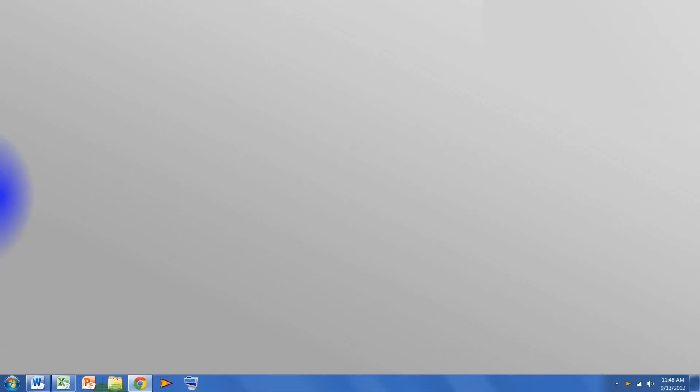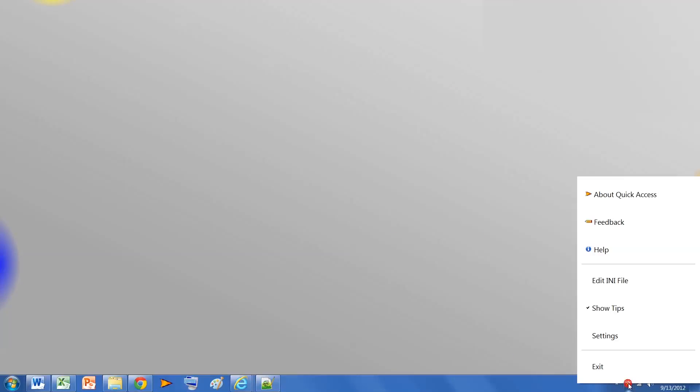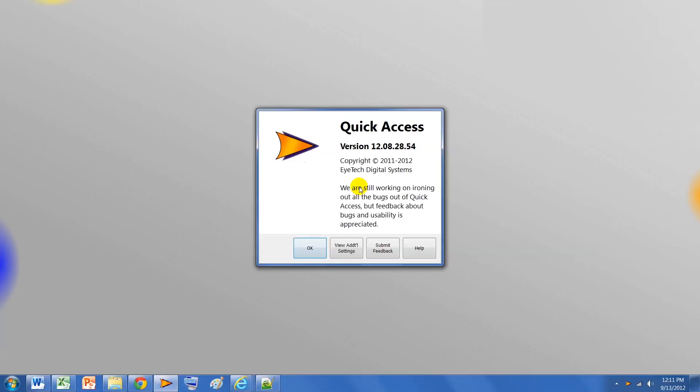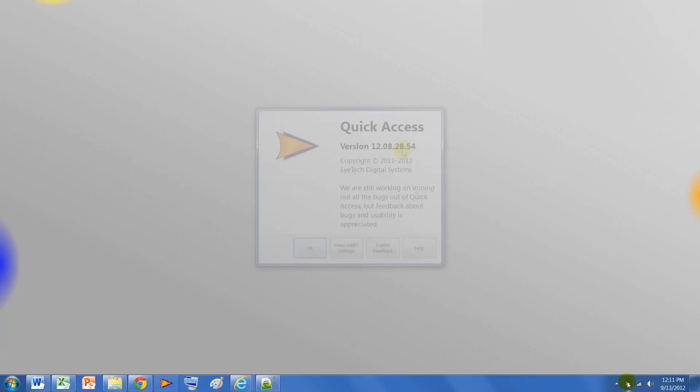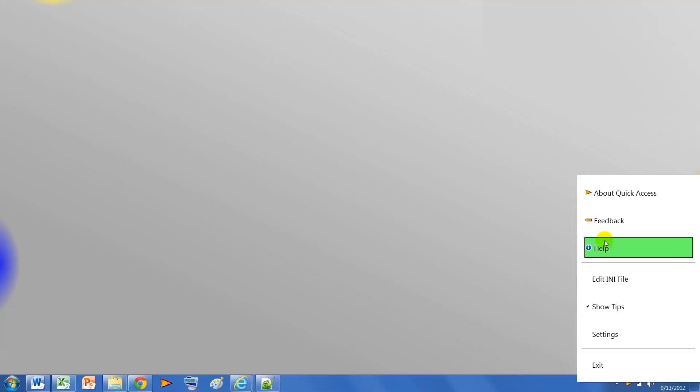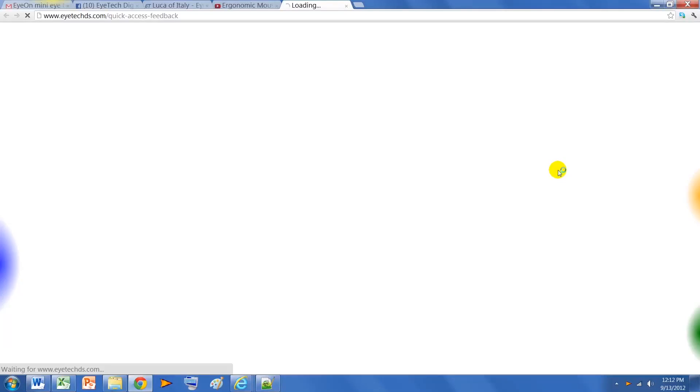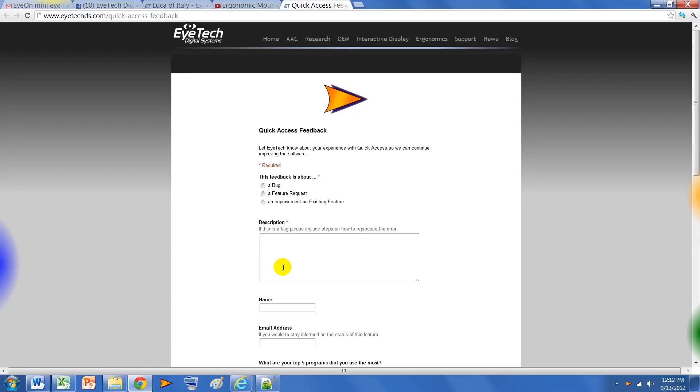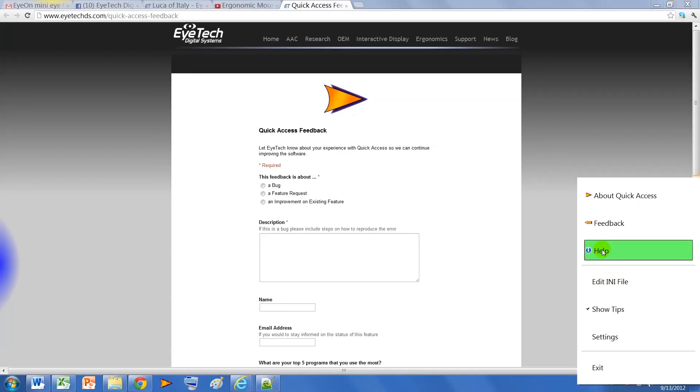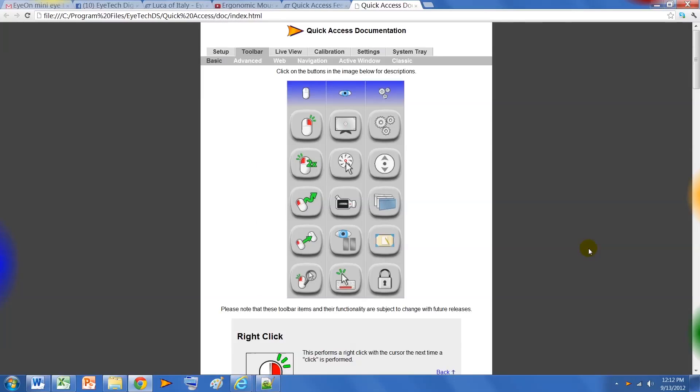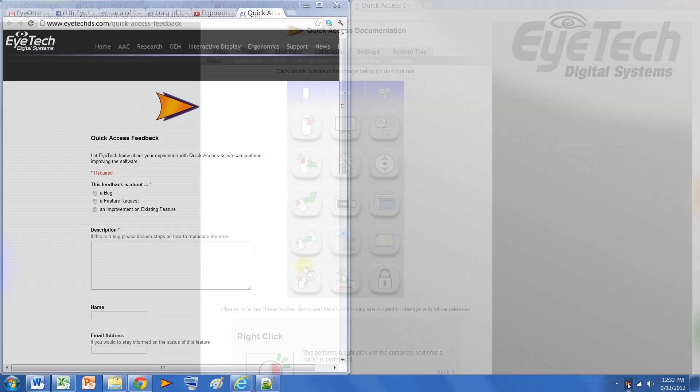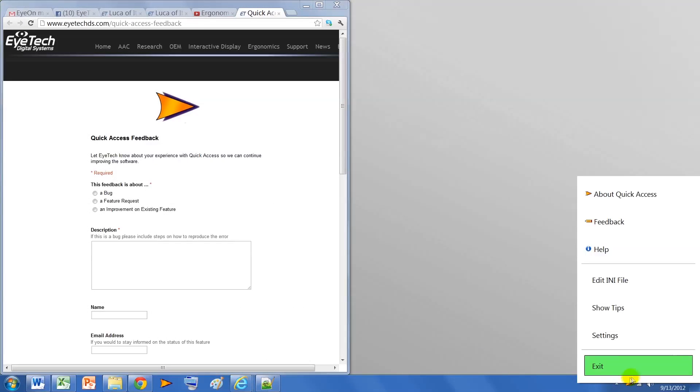And one more new feature we'll touch on is the new system tray icon. Simply click on the quick access icon to view About Quick Access to see which version of software is running, submit feedback, which is always appreciated, help to read a detailed overview of Quick Access, and exit to close the Quick Access program.